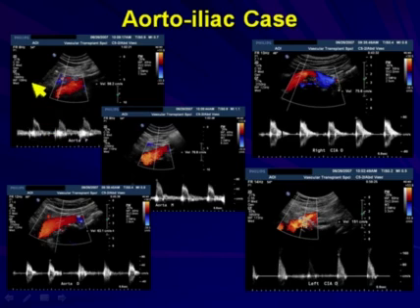We would look at the proximal aorta, the mid-aorta, and the distal aorta. We would be looking for any aneurysmal dilatation as well as any stenoses while we are assessing this in both transverse and longitudinal views. Then we look at the origins of both common iliac arteries, and you can see that there's quite a bit of difference in the waveform here.